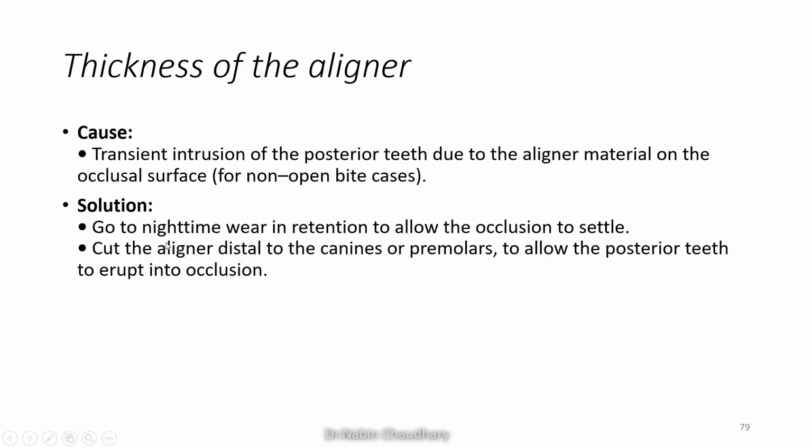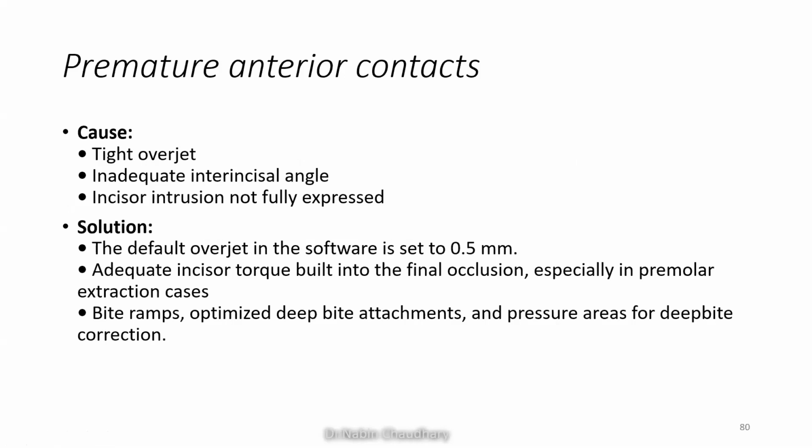So in such case, we can go to nighttime wear in the retention phase to allow the occlusion to settle, and also we can cut the aligner distal to the canine or premolar to allow the posterior teeth to erupt spontaneously.